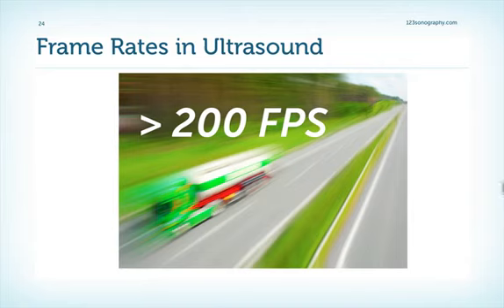But the question remains, why do we need such high frame rates in the first place? They're higher or quicker than what our eye is able to grasp. Well, Marion is going to show you now in a demo what it is good for in ultrasound.